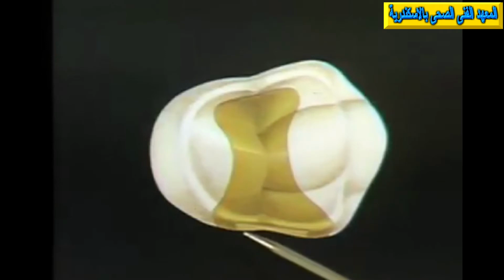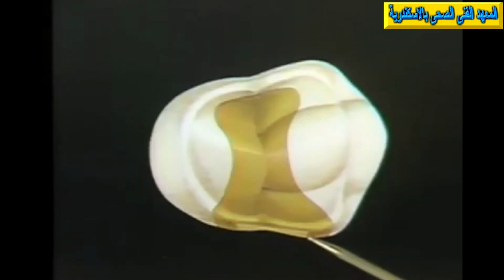The gold restoration for the retainer in which the semi-rigid connector is going to be placed is fabricated first in building the bridge. This diagram would represent the gold class 2 inlay in position on the die on the working laboratory model. The first step is to cut a facing on the proximal surface where the semi-rigid connector is going to be placed. And as you've seen previously, this facing is lined up with the line of draw of the bridge.